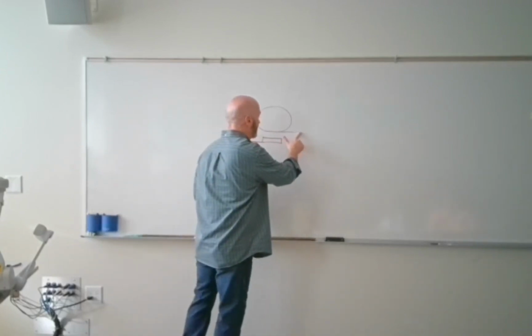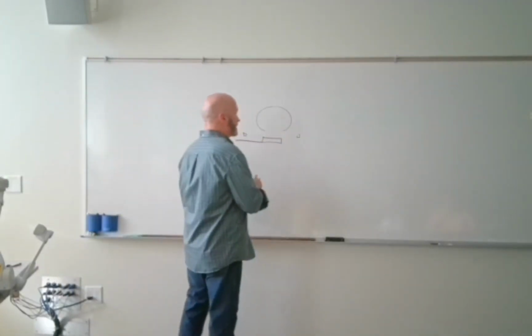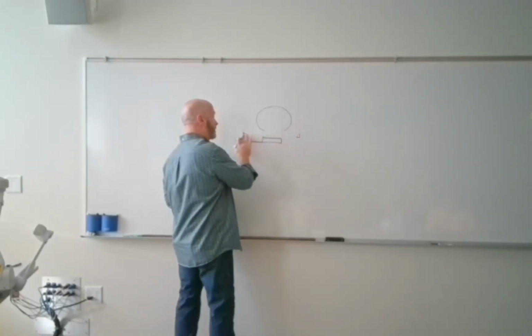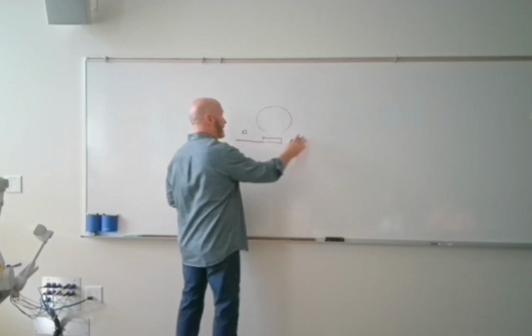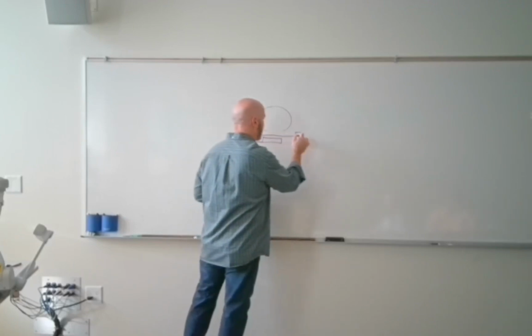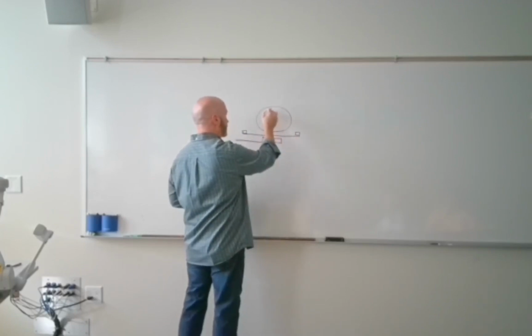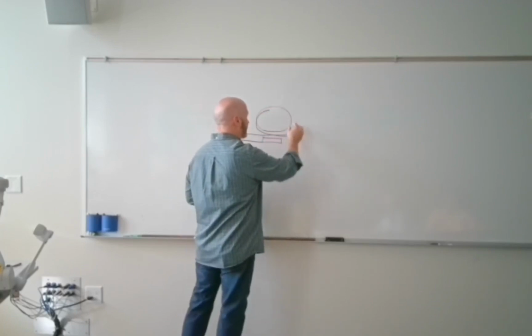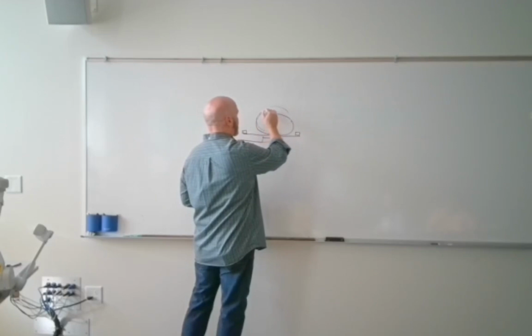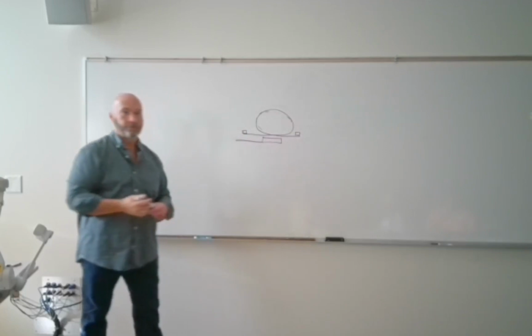What we can do is take the tabletop, instead of putting the tabletop on top of the braces, put the braces on top and suspend the tabletop from it, like that. Now our OID, we can pull our patient down closer, and did we reduce our OID? And the answer is yeah. This patient is now asymmetric. We reduced our OID, which increased our sharpness of recorded detail.